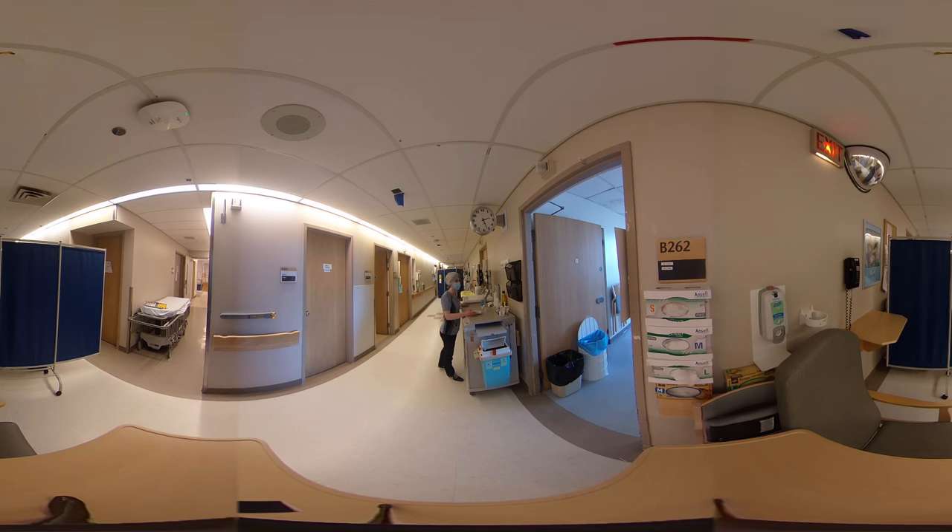Now that I have the pills prepared, I can don my PPE. I'll perform hand hygiene, and I start by donning my gown. I'll do the ties up at the top, and then do the ties around the back.